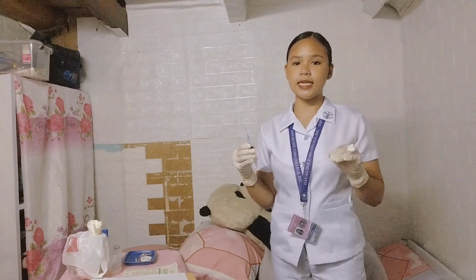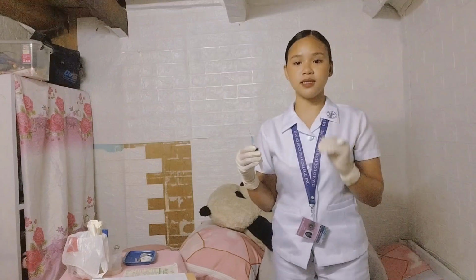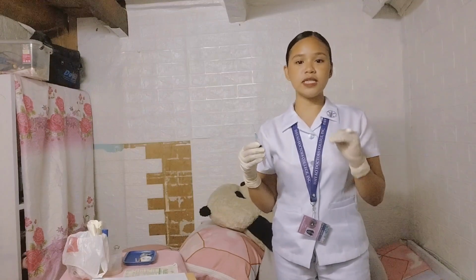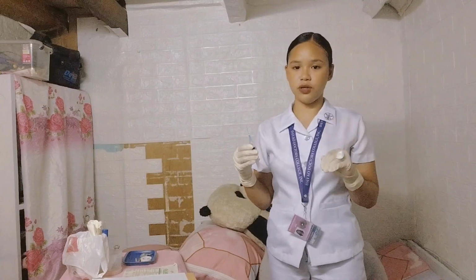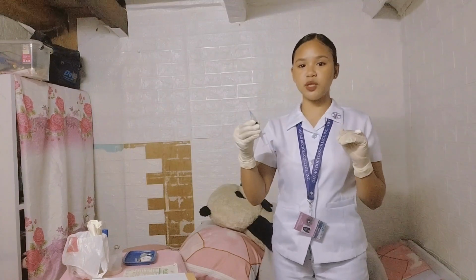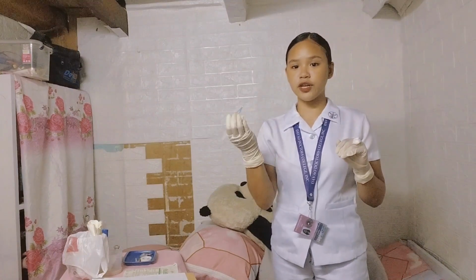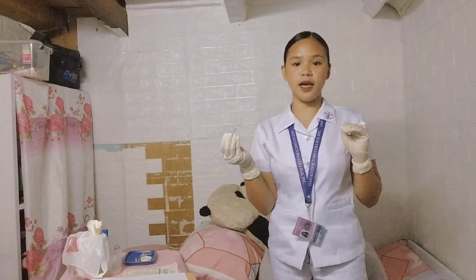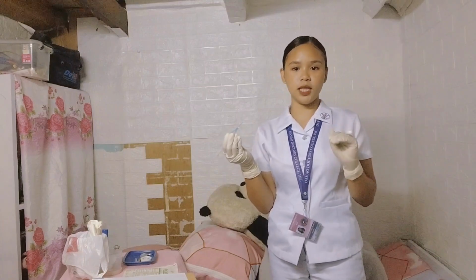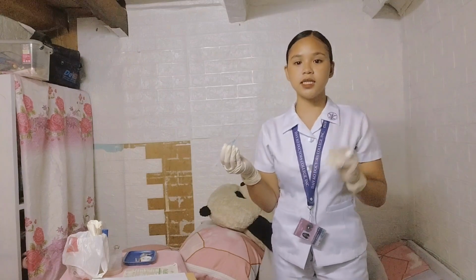Pulling the skin and subcutaneous tissue or pinching the muscle makes it firmer and facilitates needle insertion. Also hold the syringe between the thumb and forefinger as if you're holding a pen, and pierce the skin quickly and smoothly at a 90-degree angle.